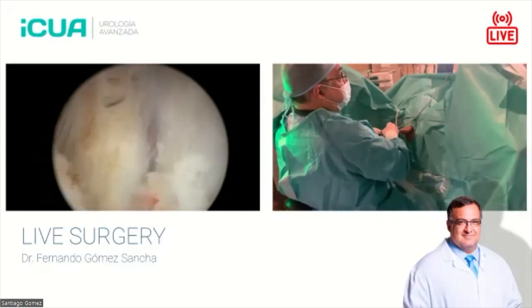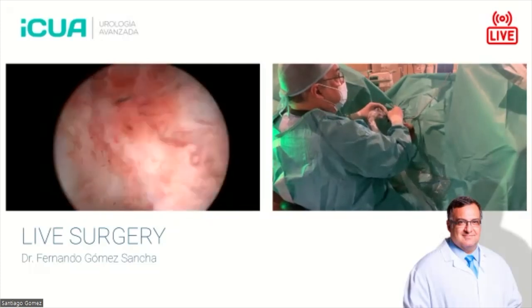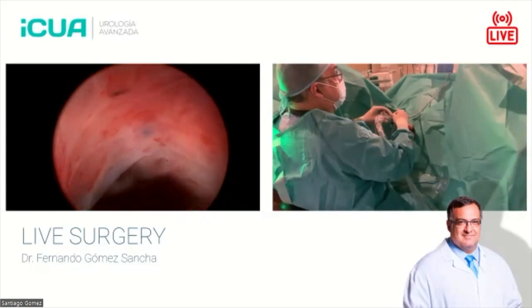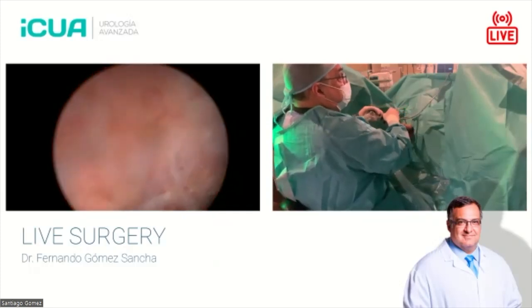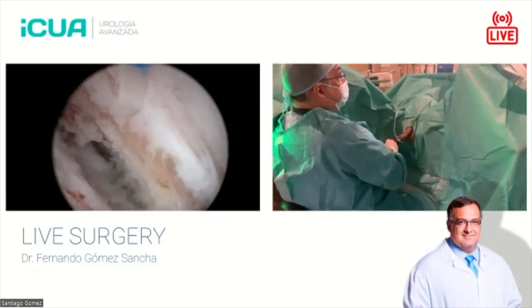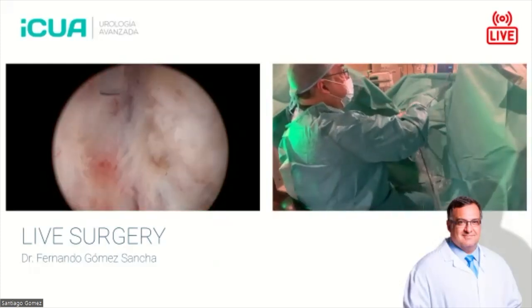In this phase of the operation, the idea is that the sphincter has been released completely. And if we come out, you will see here the sphincter's mucosa. There is some small bleeder, but the sphincter has been preserved exactly up to the line that we marked. Now we just have to go around the adenoma. We can go all the way around on both sides. And it's very simple.